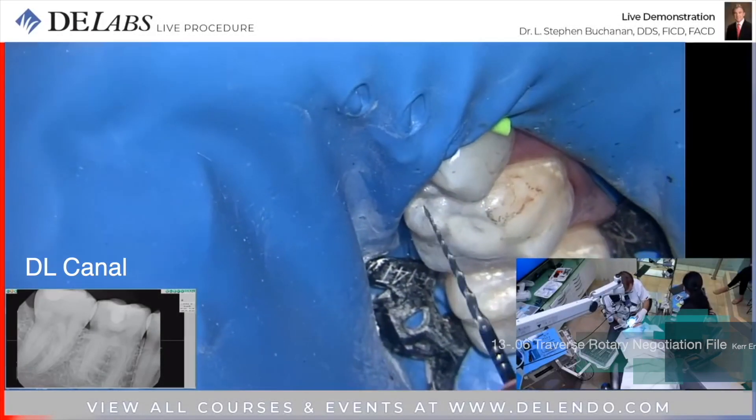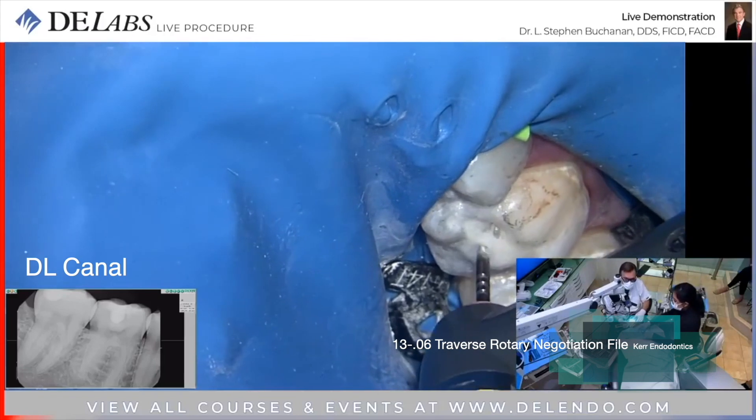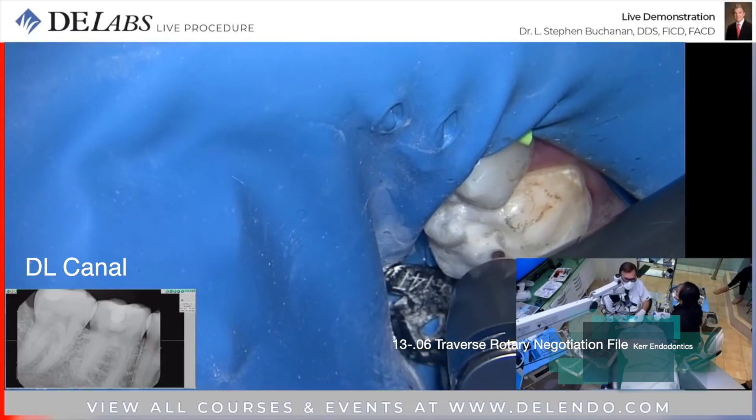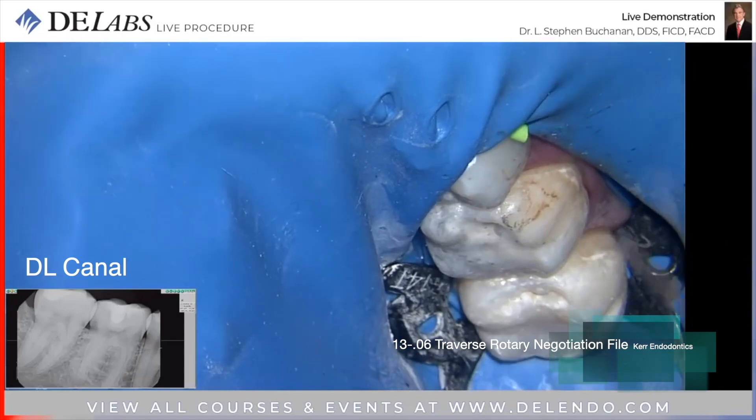We see a 1306 traverse rotary negotiating file cutting to length. This was done as a live demonstration broadcast to the internet.